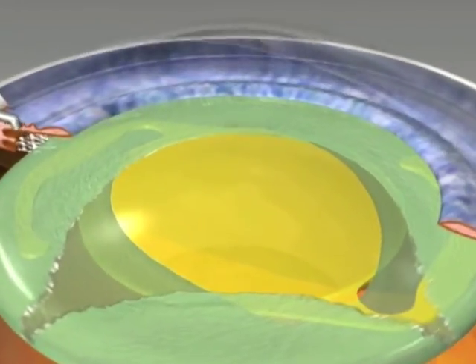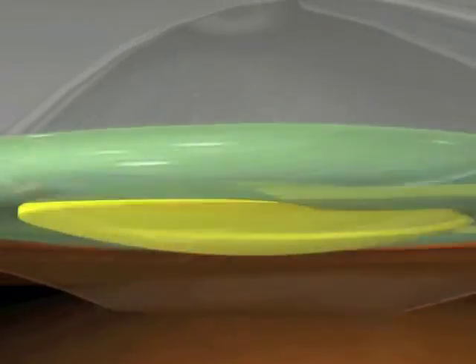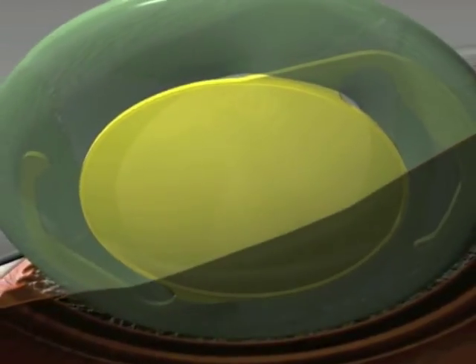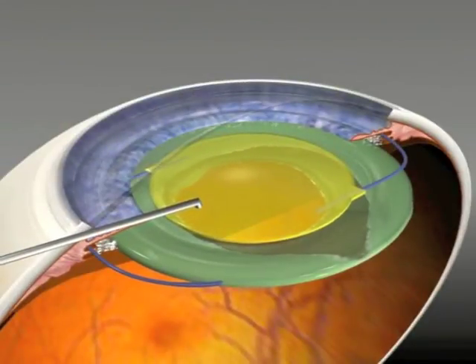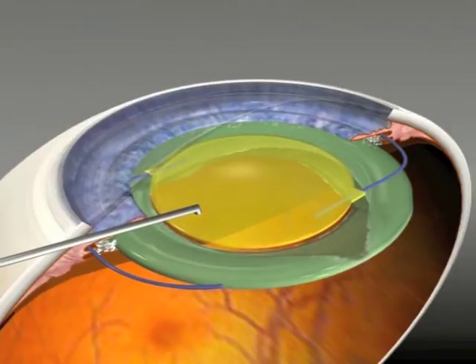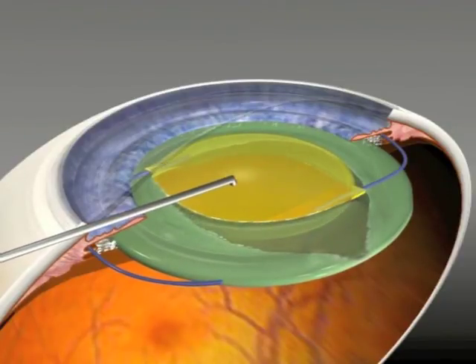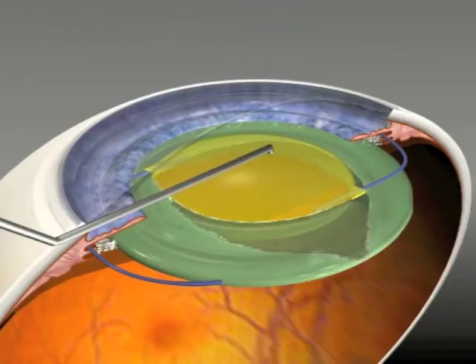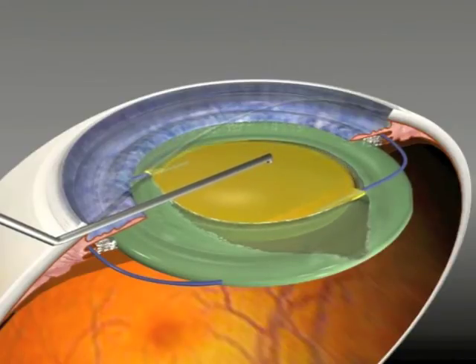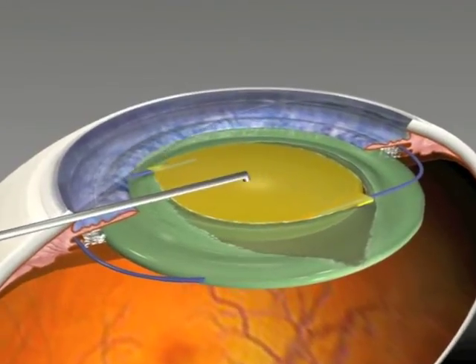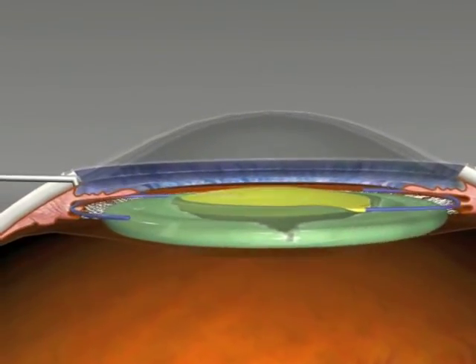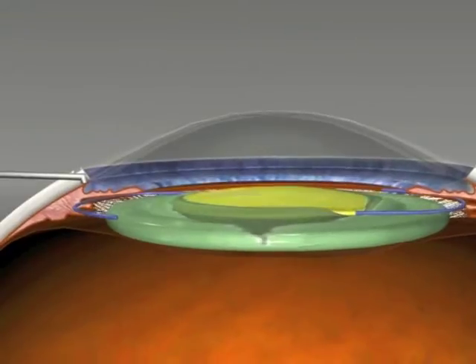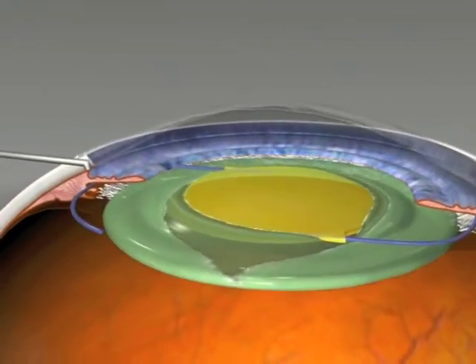If a large anterior capsule tear is present making in-bag fixation unsafe, especially with a three-piece lens, a posterior capsule rexus of the appropriate size can be made and the lens put in the sulcus, the optic pushed through that anterior capsule opening and then through the posterior capsule for capsule fixation and certain centration and fixation.